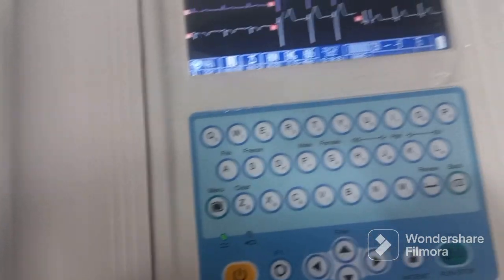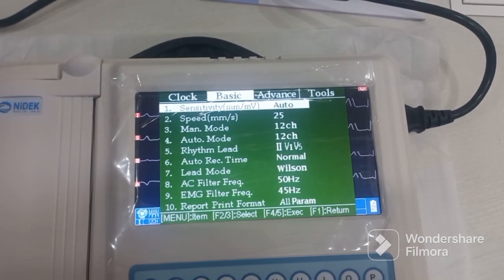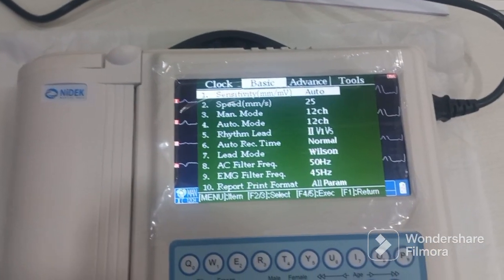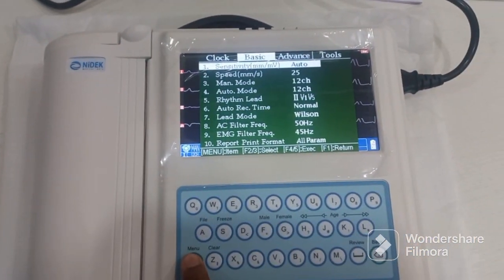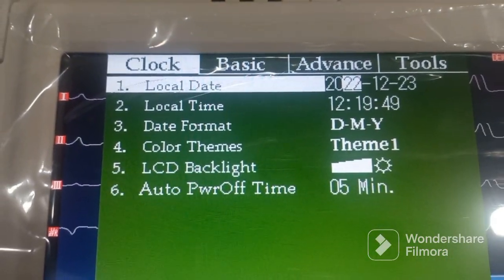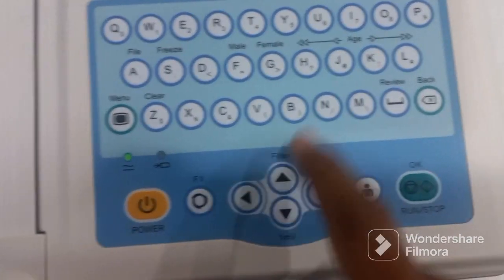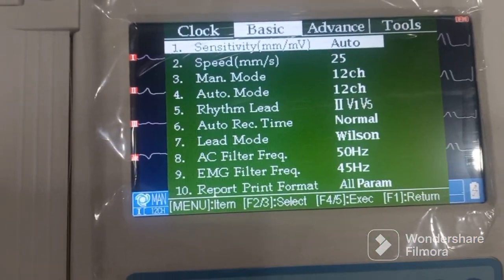Now let's look at the settings. Press the menu button and there are four menus: the clock, the basic menu, the advanced menu, and tools. You keep pressing the menu button to toggle between them. In the clock menu you can set the date and time using the navigation key and the alphanumeric keypad.